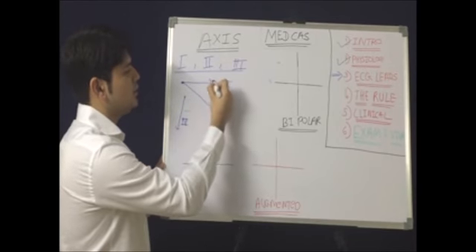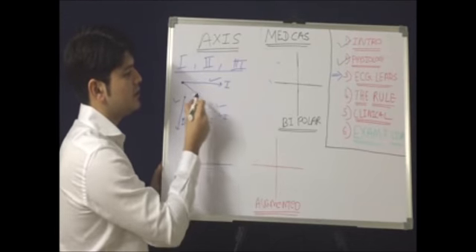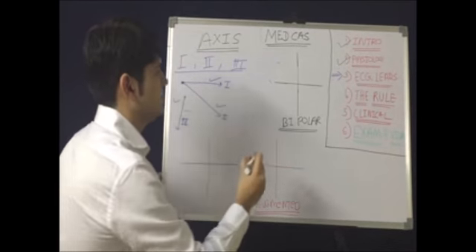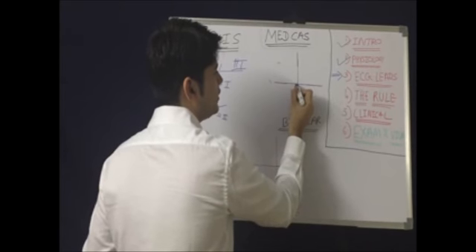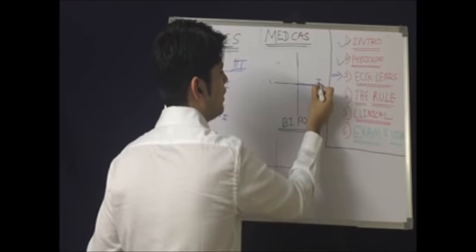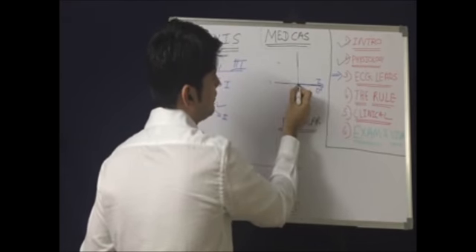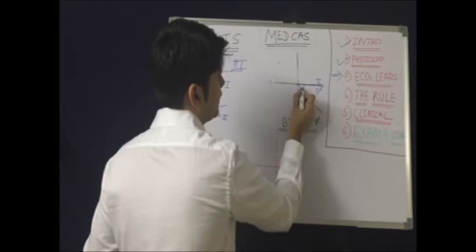So you can see here lead 1, lead 2, lead 3, which are our bipolar leads. Let's put it on a graph. If I put lead 1 going in this direction, I call it 0 degrees. Lead 2, starting from the right upper limb to the left lower limb in this direction, is at around a 60 degree angle.